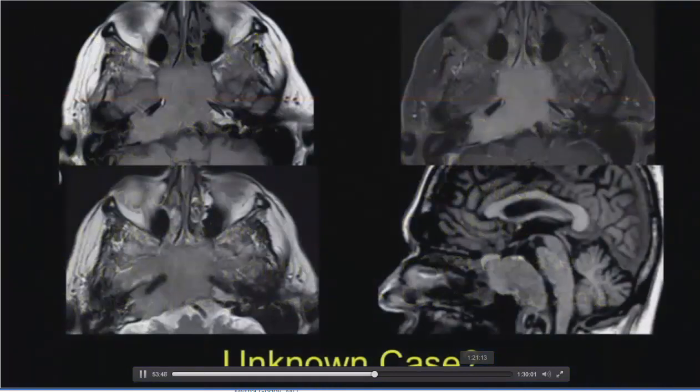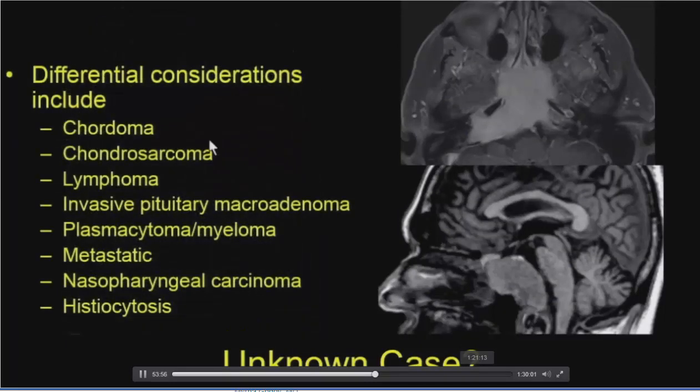So here's that case that we had before. They showed me this case, and I looked at it, and I said, I think it's probably this. And they told me later that it was. So this is the report that it was. They had this big differential. So I sat down and I looked at their differential, looked at the imaging, and walked through with them why it is or is not all of these things.